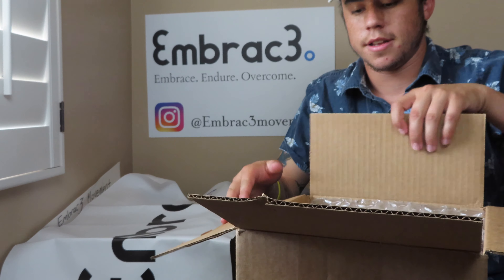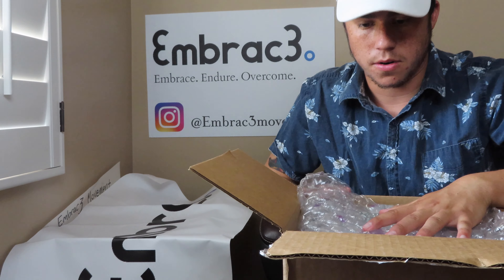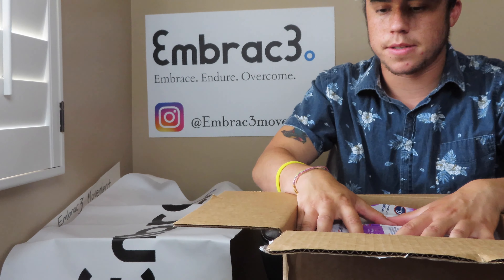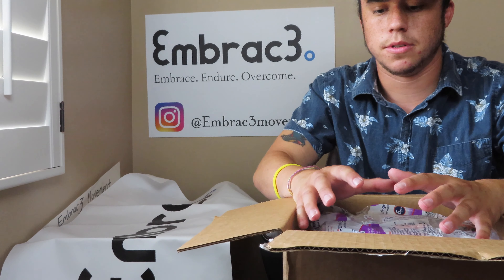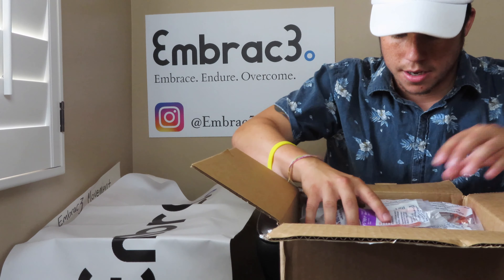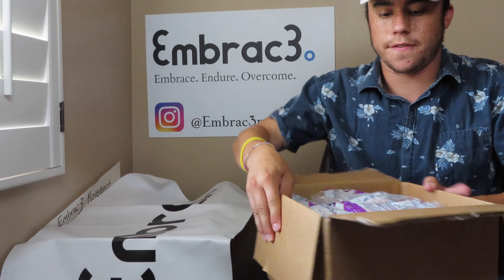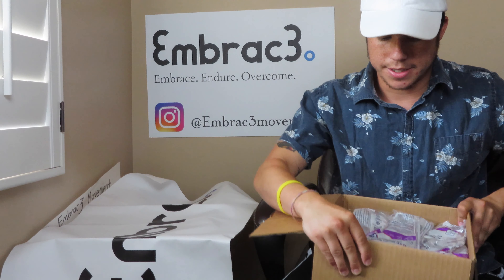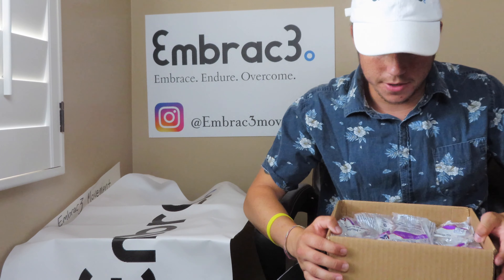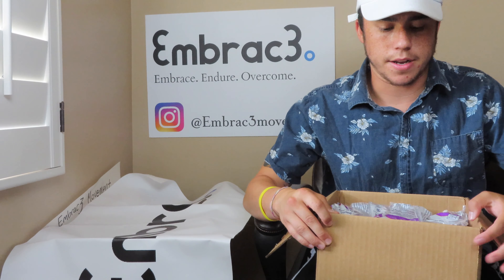Oh my gosh, holy crap! There's bubble wrap — this was actually sent to us from what looks like an actual business because it was freshly wrapped. Look what we got! There's a lot jam-packed in this one box. I'm very excited. First off, I can already see there are insulin syringes, and we have a huge need for insulin syringes.